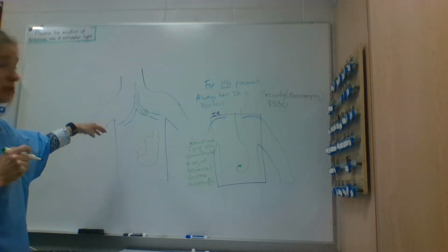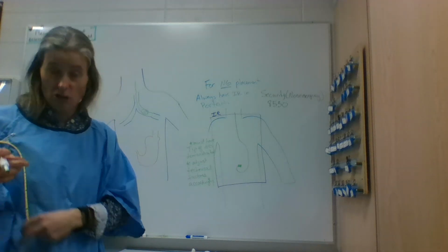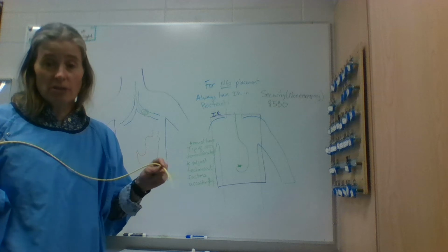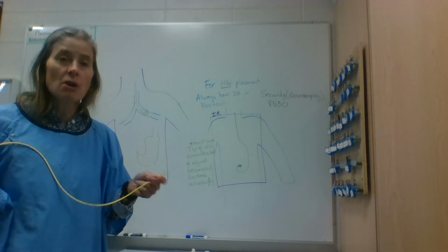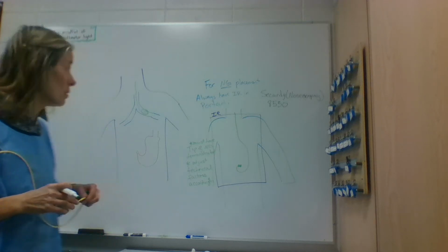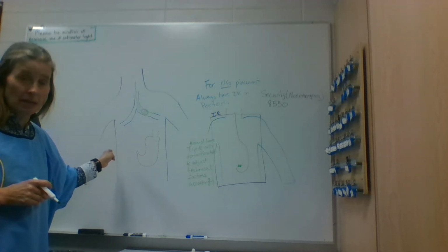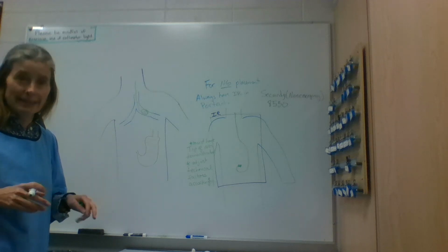And that's obviously not where you want it, especially if one of the purposes is feeding, and they start to put different nutrients down. Now we're running into serious problems because it will result in aspiration pneumonia. So we always take a chest x-ray, just an AP chest x-ray, to confirm nasogastric tube placement.